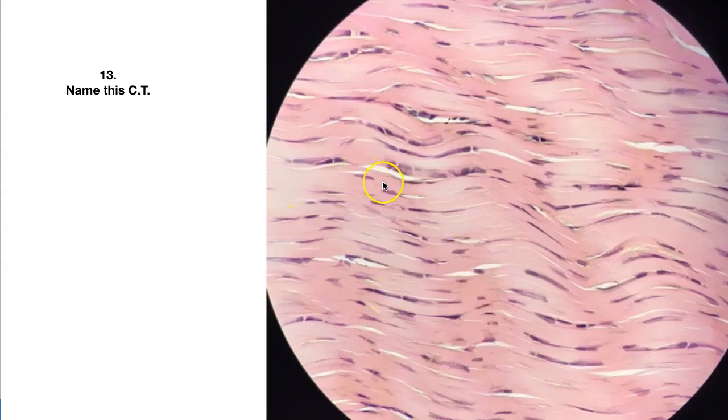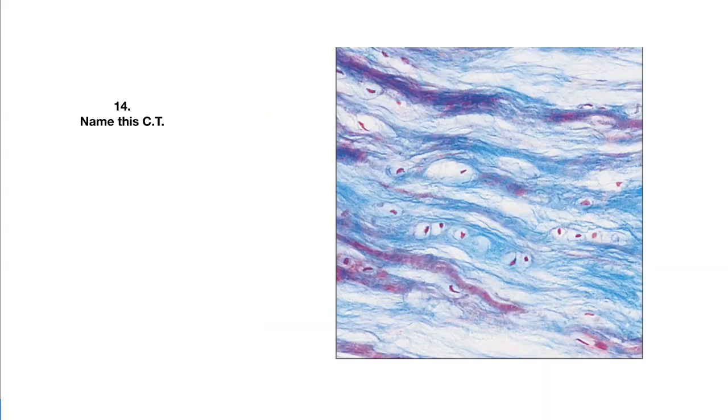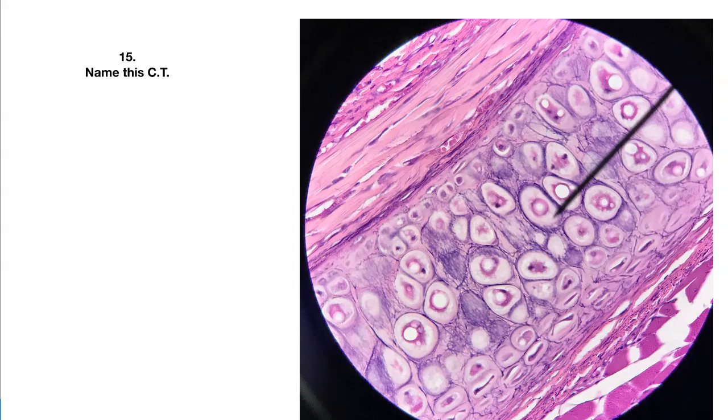Number 13. Easy to see this. What is this type of connective tissue? 14. What is this connective tissue? 15.